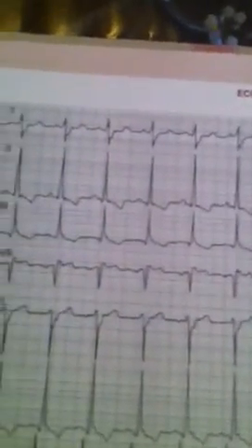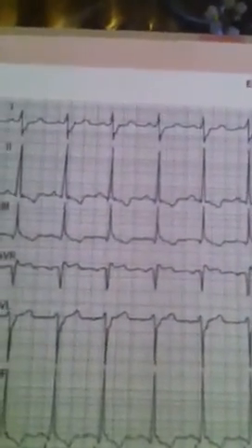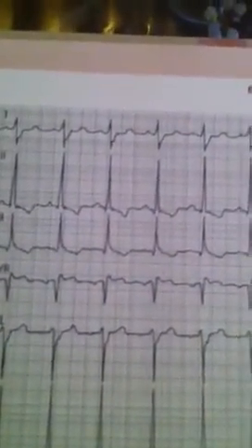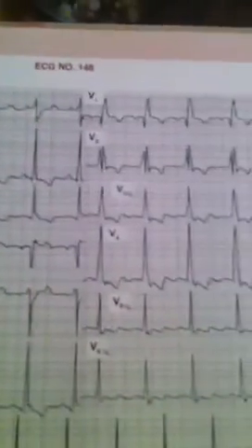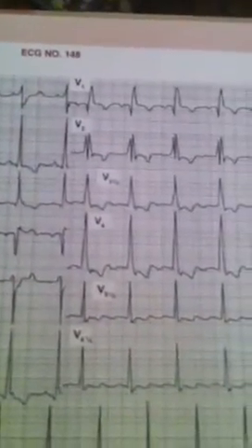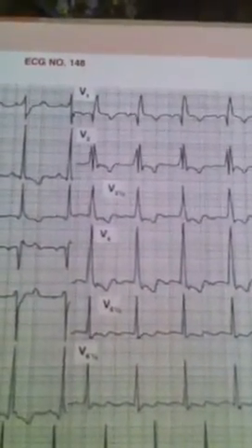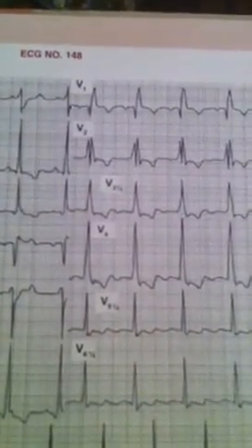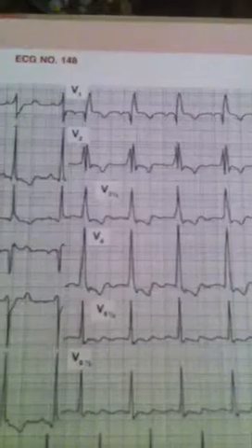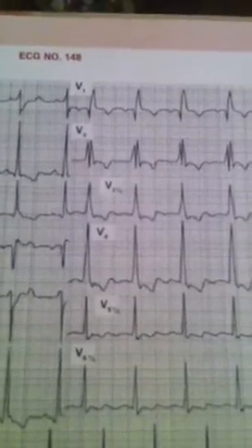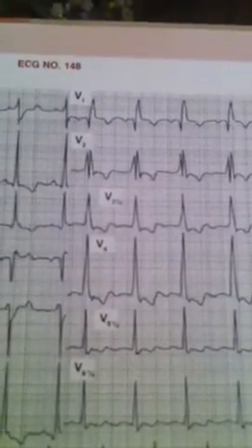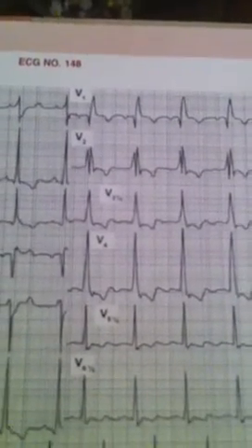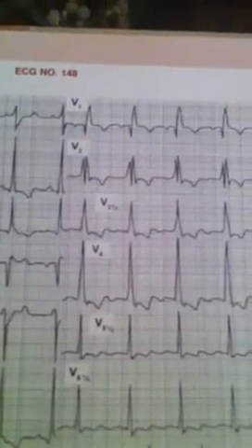So the diagnosis is right bundle branch block, left posterior hemiblock, left ventricular hypertrophy, and possibly anteroseptal infarction due to the presence of the initial Q in V1.